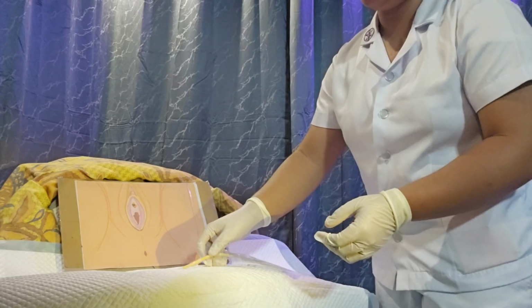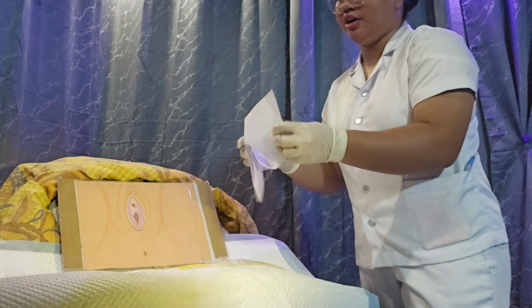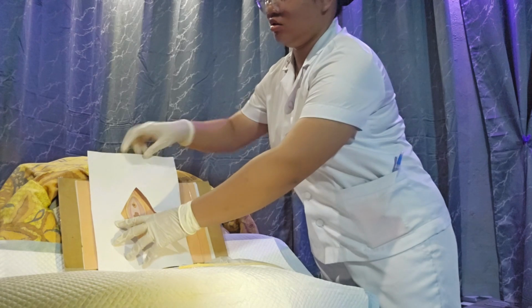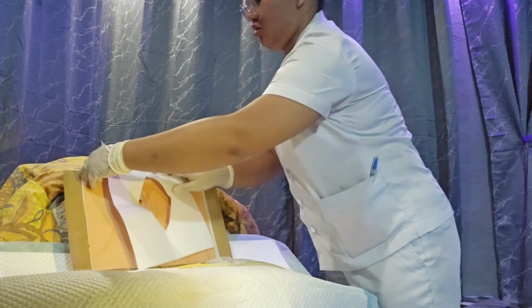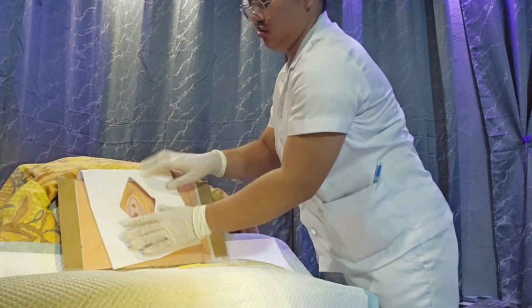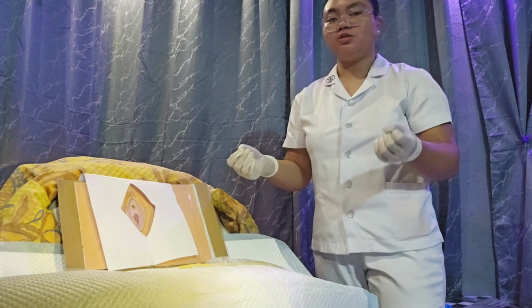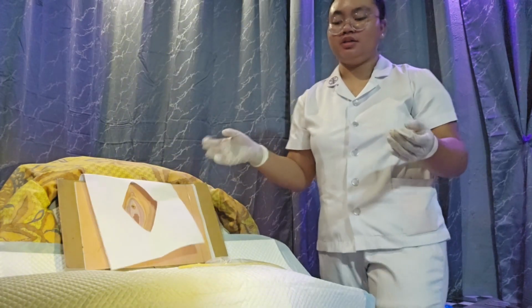So after lubricating, we are also going to place an eye sheet over the area of the genital to avoid exposing too much of the perineal area. So after placing the eye sheet, we are also going to clean the meatus to ensure that before placing the catheter, the area is already clean.